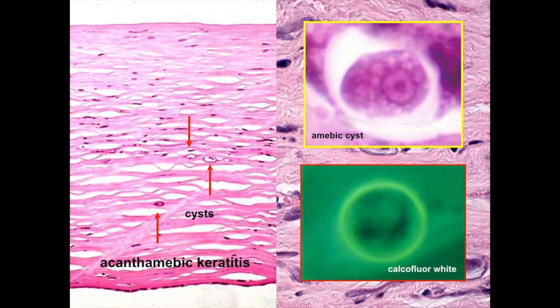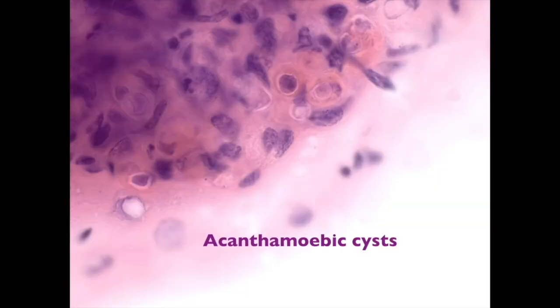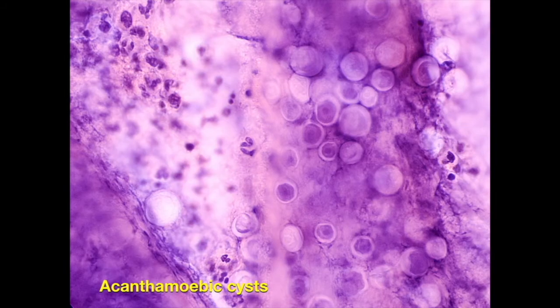There's literature in the past that talked about the use of the calcofluor white stain, a nonspecific fluorescent stain, but I'm not aware of that being readily available much anymore. This is a conjunctival scraping showing the presence of multiple acanthamoeba cysts with their chitinous walls, readily visible in the H&E stain preparation. Here's a rather florid example of acanthamoeba cysts in a recent conjunctival smear.